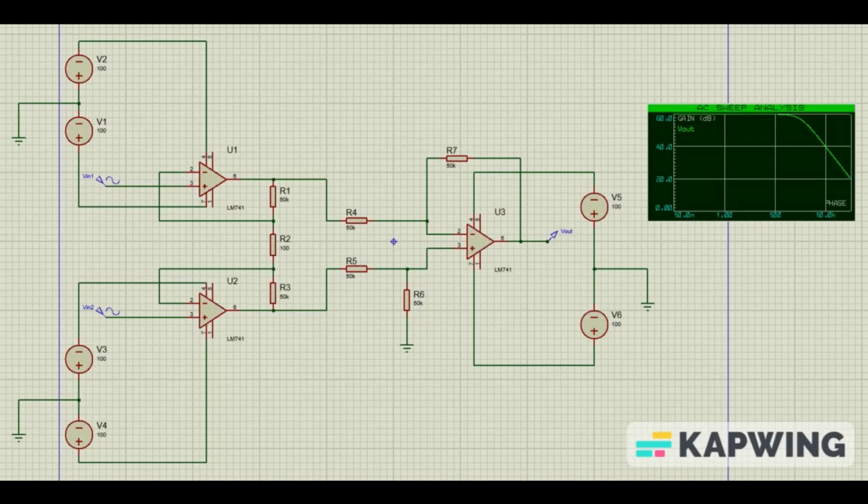In this specific circuit, we used R to be 50k and RF to be 100. So as a whole, we will get a factor of 500. As can be seen from the AC sweep, we have got around 60 decibels gain, since based on the calculation, we will get around that value when we finish the calculation of the gain in decibels.